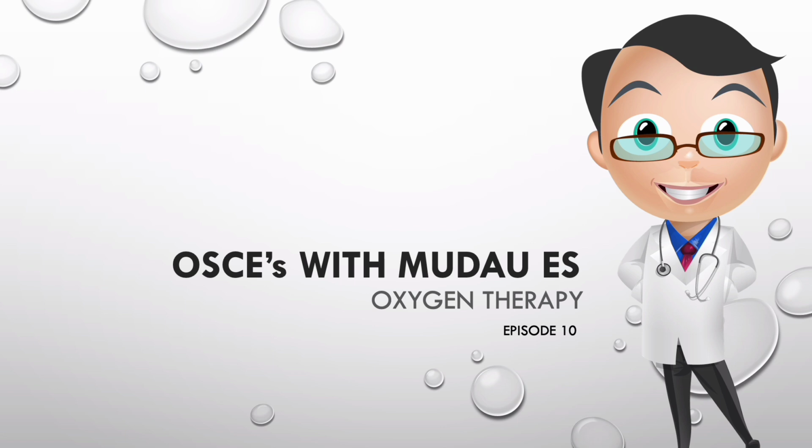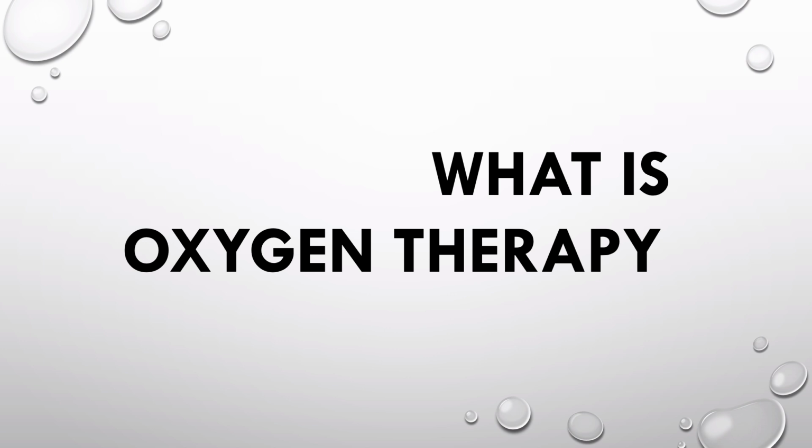Today we will be doing oxygen therapy. Oxygen therapy is a procedure of administering oxygen to the patient at a higher concentration than that in the atmospheric air, with the intention of promoting and managing adequate ventilation and oxygenation of the blood tissues.